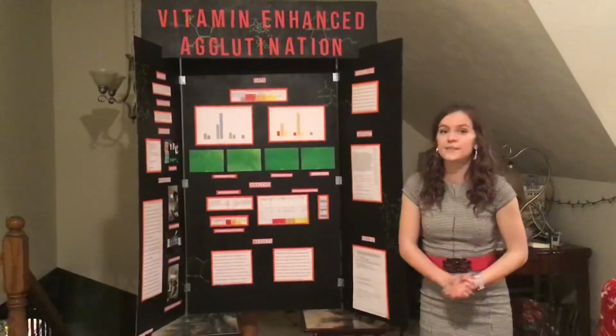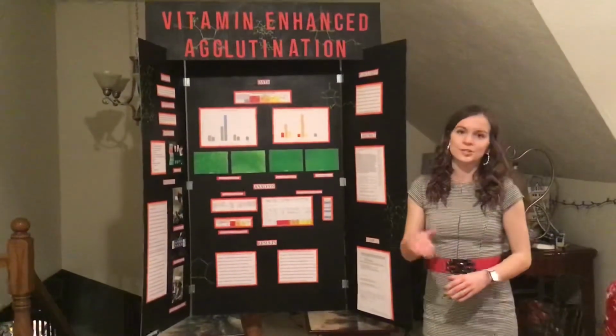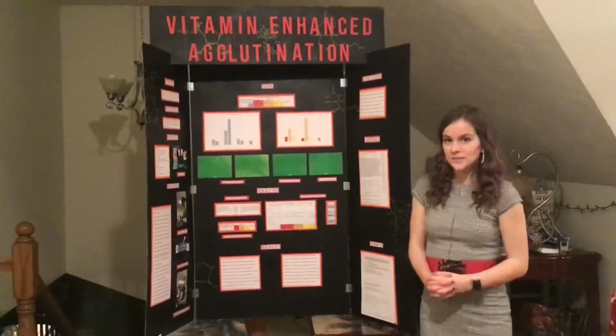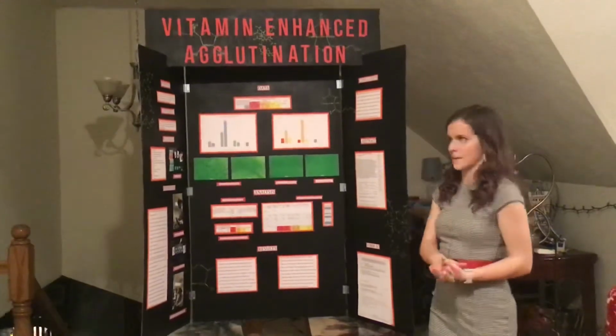I did 5 trials of each vitamin and each concentration. I then took the highest dilution denominator and I averaged these between the 5 trials. I put them into graphs, and as you can see here, I have 2 different graphs displaying the same information.